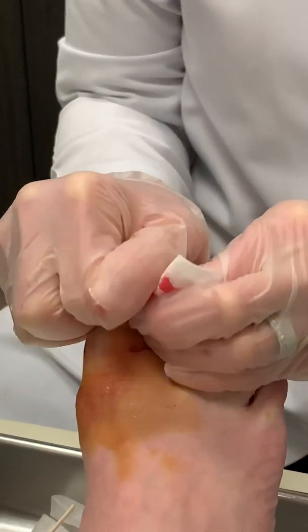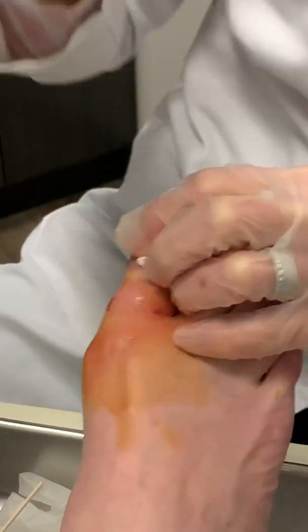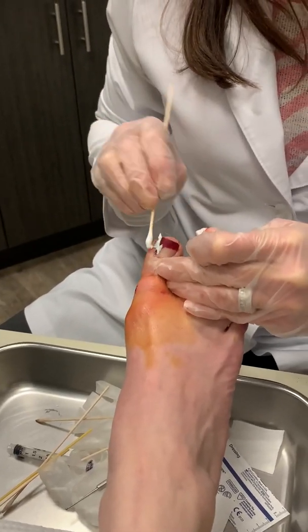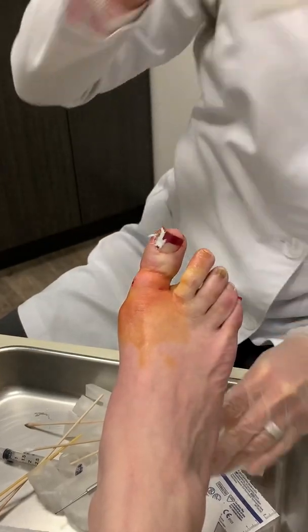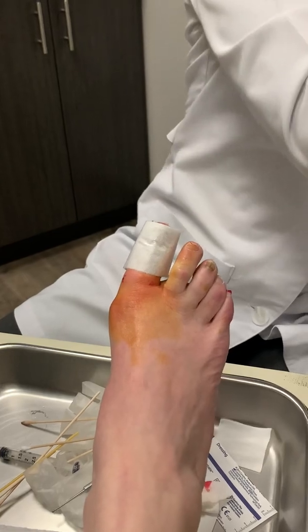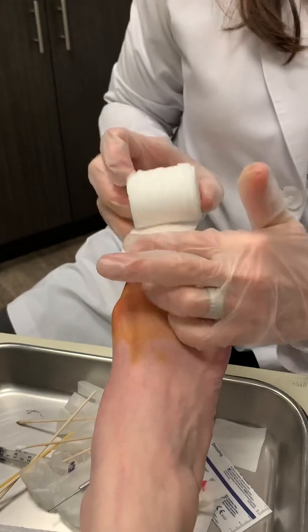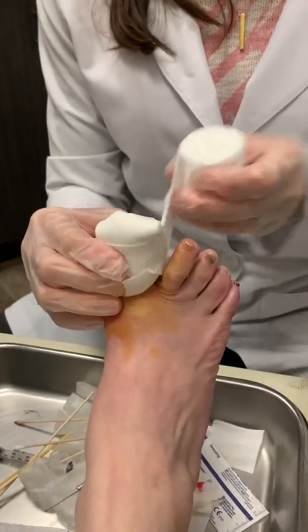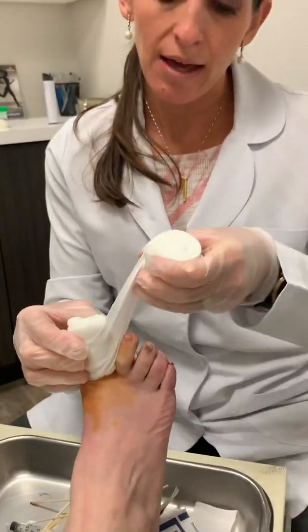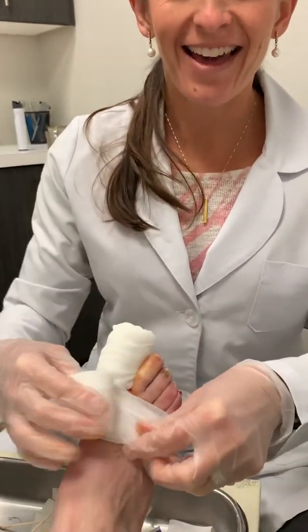I'm going to remove the tourniquet and show you the bandage that she will leave with. We apply Silvadene, which is an antibiotic that's actually really good for burns, and then we put a non-adhesive dressing followed by some gauze. The bandage will stay on until tomorrow morning, and then starting tomorrow morning she'll be able to take that off and begin her twice-daily soaks. She will be coming back in about two weeks for a repeat follow-up. And that is it.